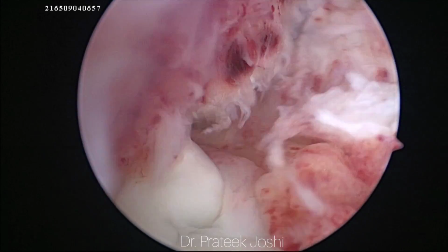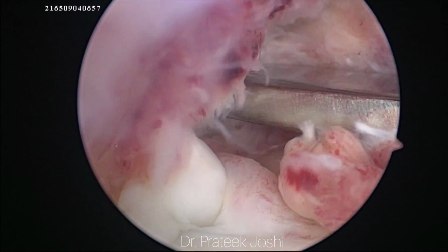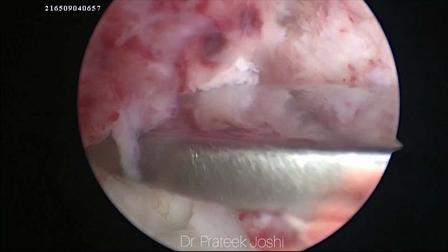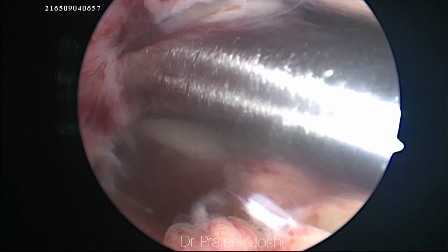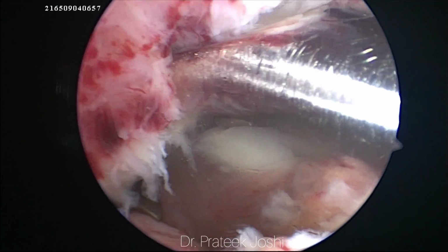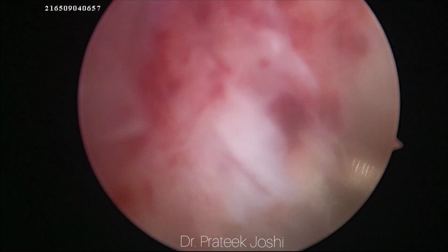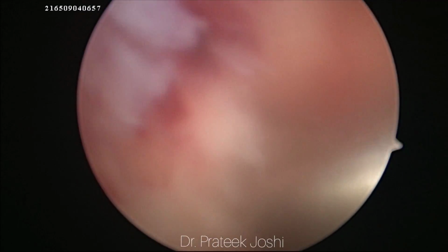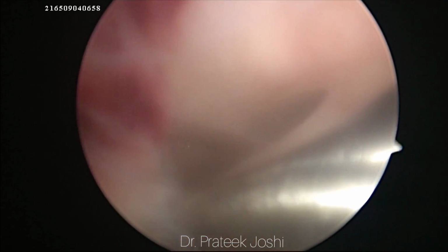Prateek Joshi. This patient had a twisting injury to his right knee joint after a fall from a two-wheeler, and he had pain, swelling and instability in his right knee joint afterwards. On MRI and clinical examination, he was found to have an ACL tear. The anterior cruciate ligament is one of the commonest ligaments injured after a twisting injury of the knee, and here today we are going to do arthroscopic ACL reconstruction surgery.